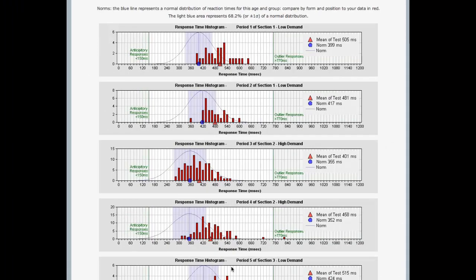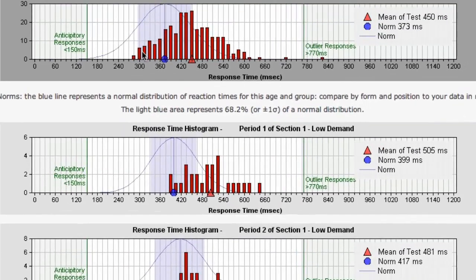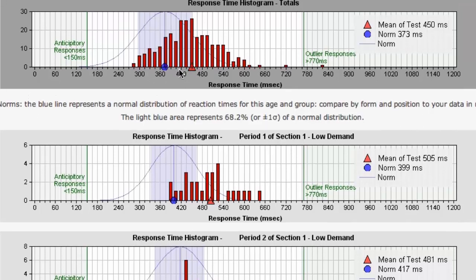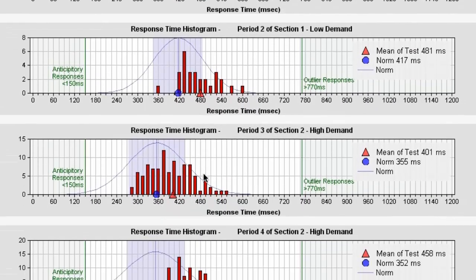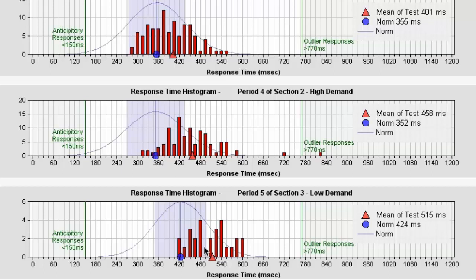We're breaking down all five periods here, and at the top we have the total. The norm here — 373 milliseconds for this age and gender — is shown with the blue circle. The mean of this person's test is slower than the norm overall. We can see how they did in each individual period and how much slower they are from the norm. Notice everybody across the norm tends to slow down again in the fifth period because it's stimulus infrequent, which lulls us into slowing down.